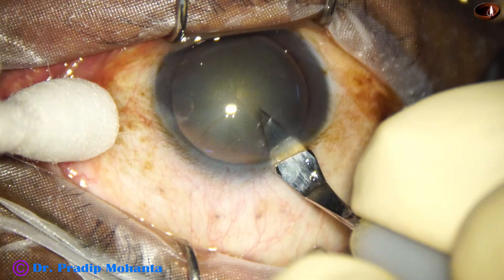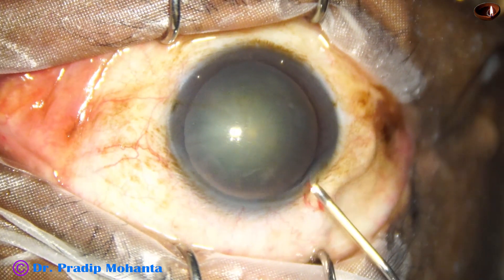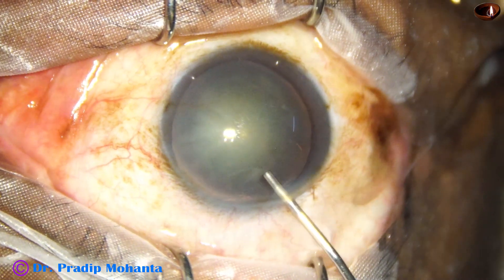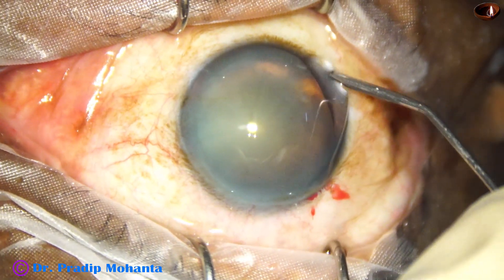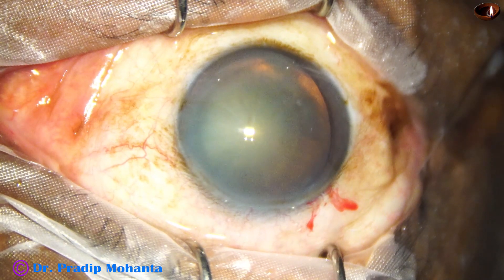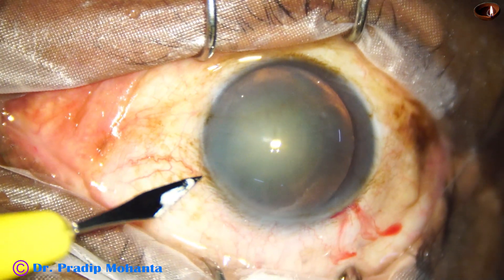This is the main incision and the anterior chamber is filled up with visco. Visco is applied over the cornea for better visibility. A side port is made on the left side of the main incision.